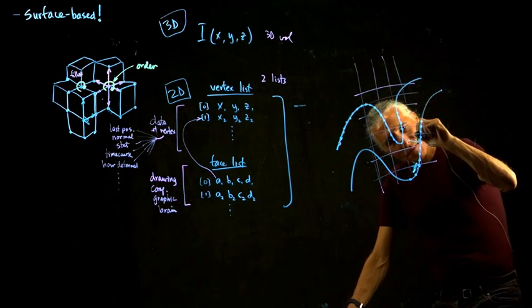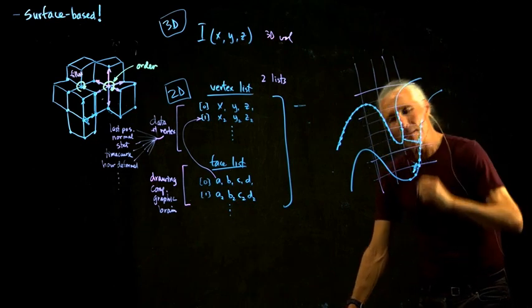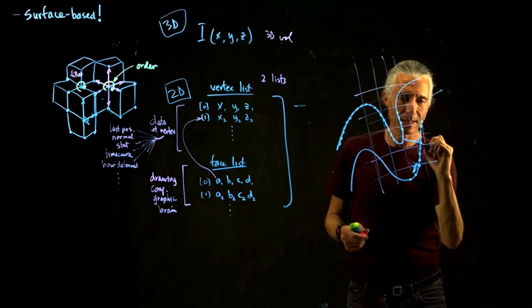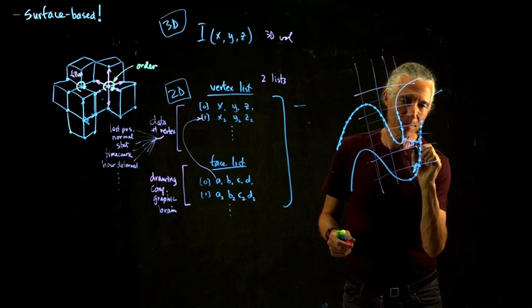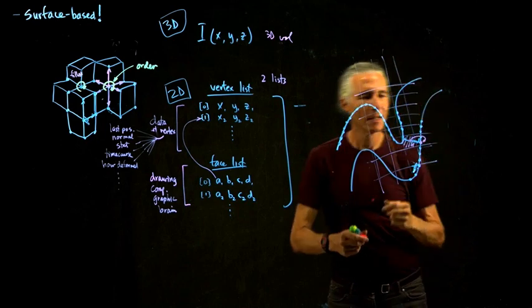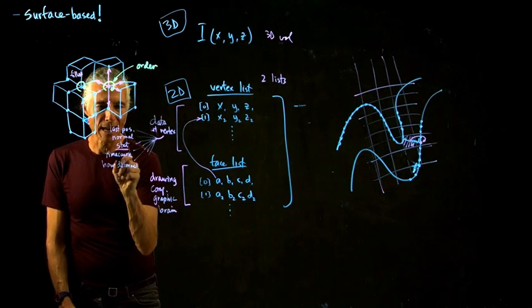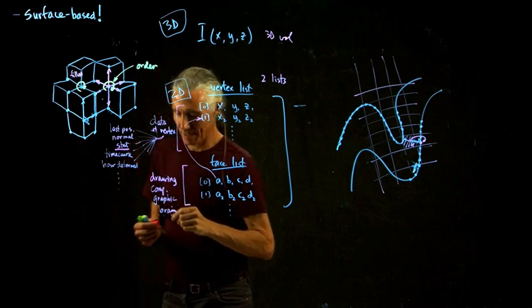And then we go up maybe about halfway to the pial surface, and then we say this vertex gets this voxel. So this voxel gets applied to that vertex. And then we've got our stat attached to a particular vertex.